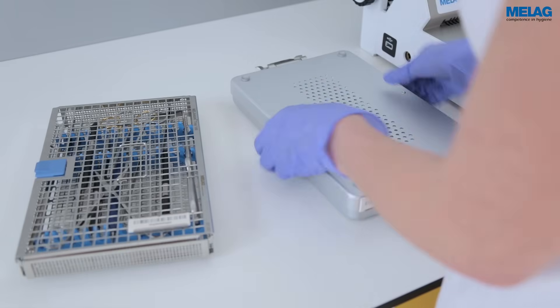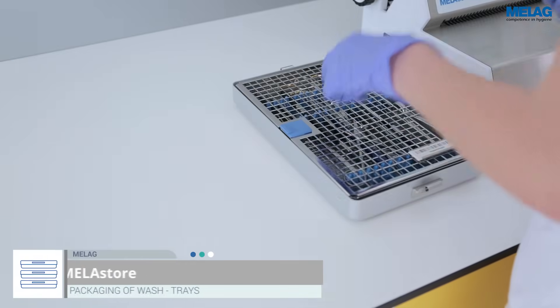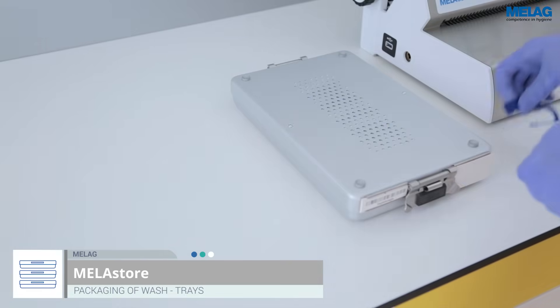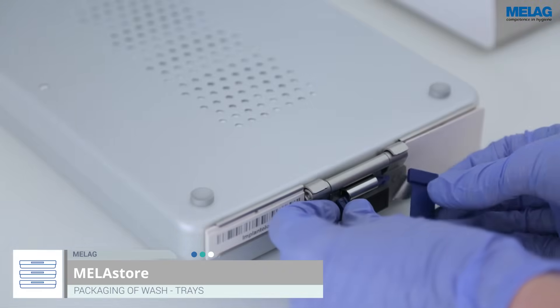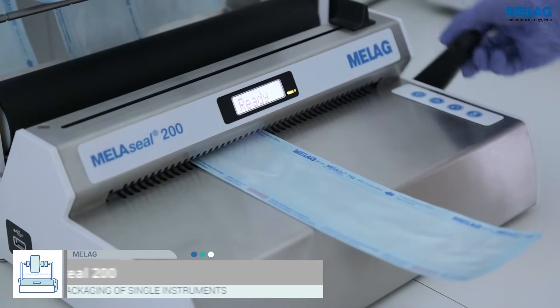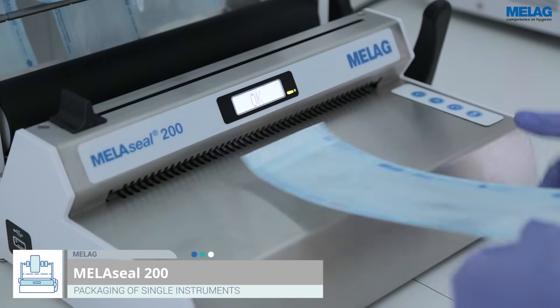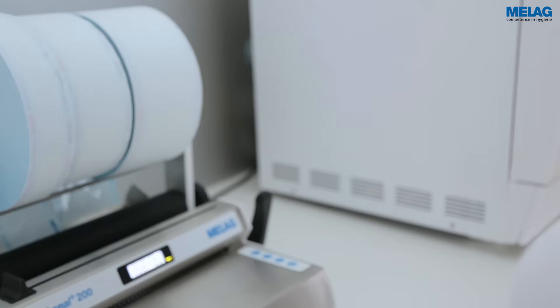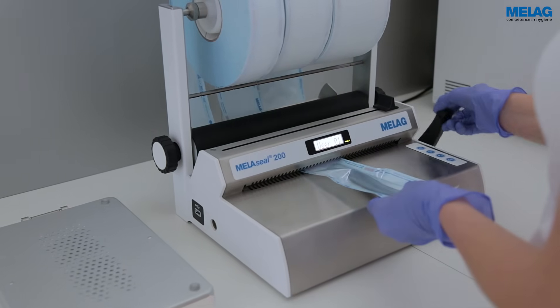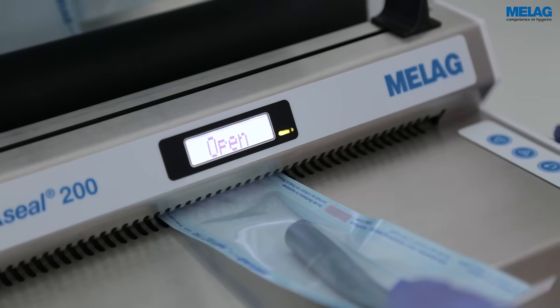The use of MeLaStor trays and MeLaStor boxes optimises workflows, leading to considerable improvements in working safety, reproducibility and efficiency. Individual instruments are wrapped in MeLaFol. The validatable sealing device MeLaSeal 200 permits a standardised and reproducible process which can be documented.